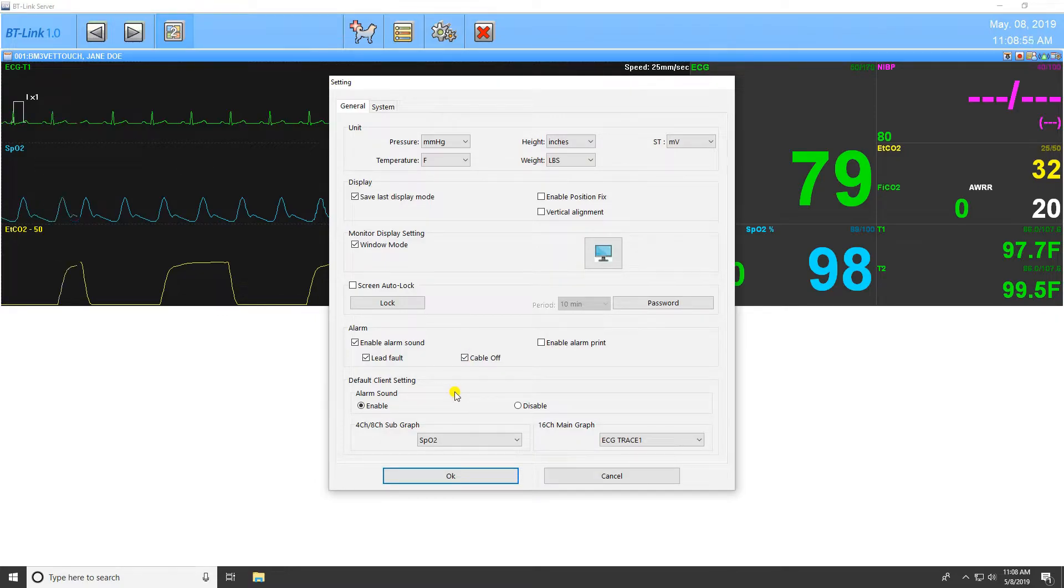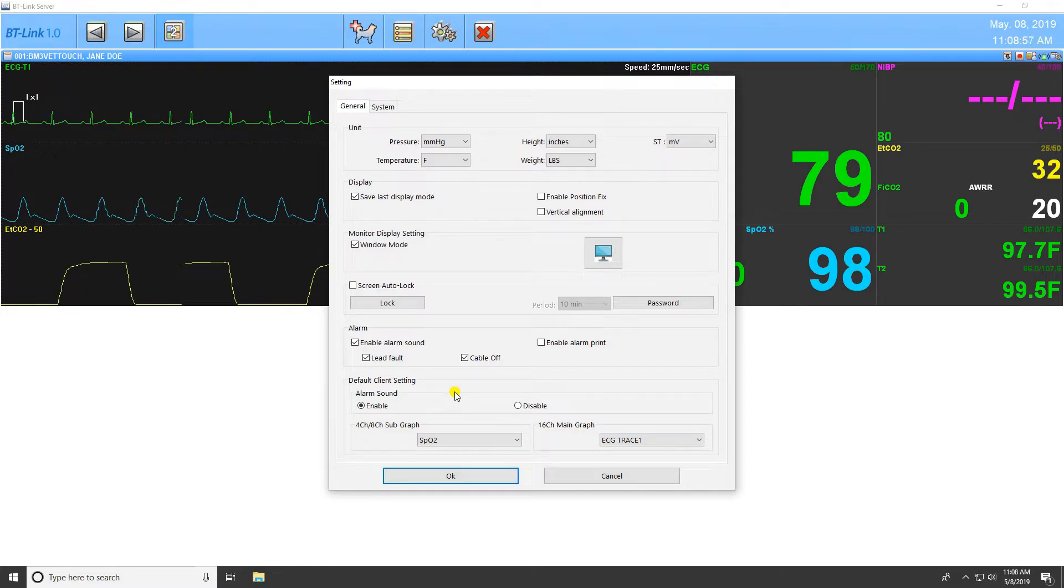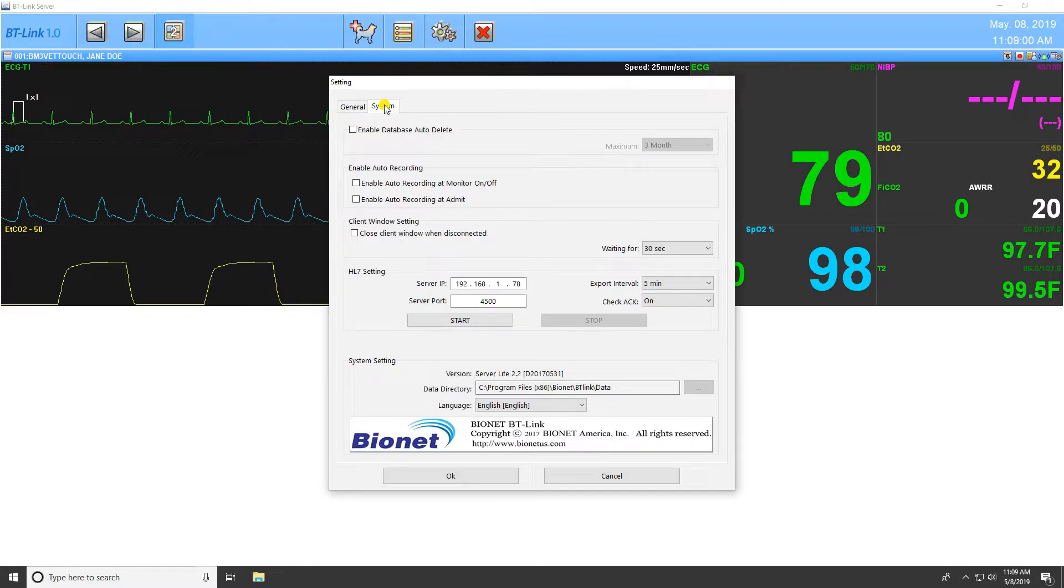The final setting on this page is the Default Client setting. These allow you to alter the default settings for when a client window is created.